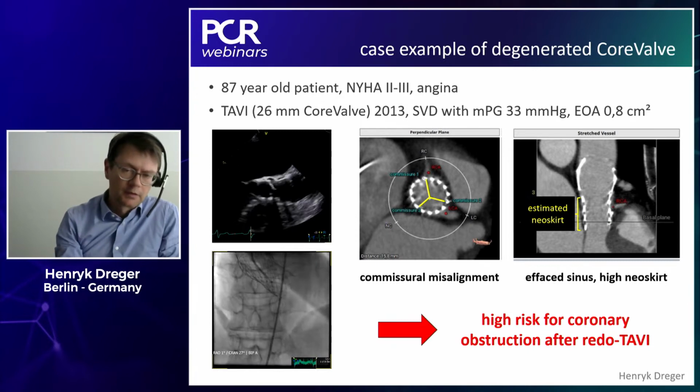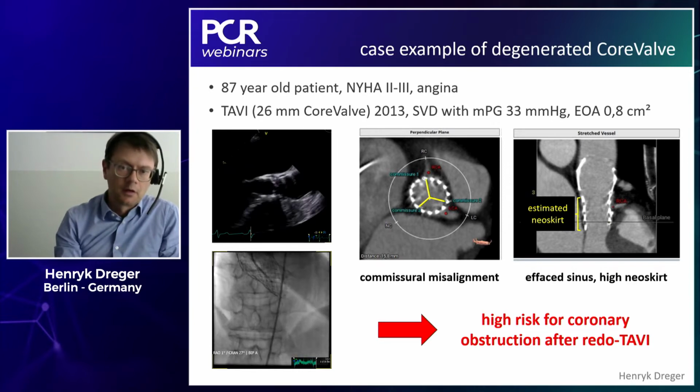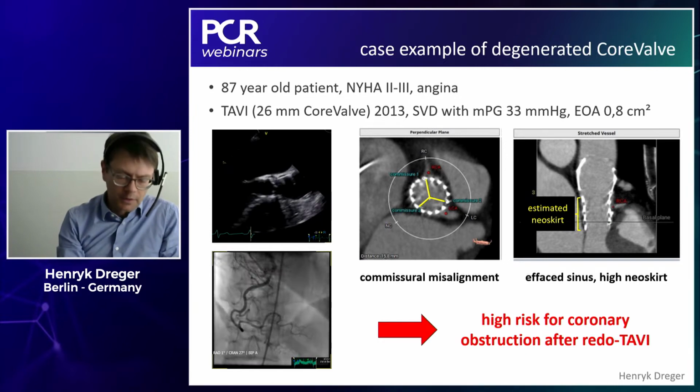So in summary, it's really important for the coronary access, but it might be even more important in our now younger and younger patients who undergo TAVI if we have to do a redo TAVI in 10 years' time in these patients.